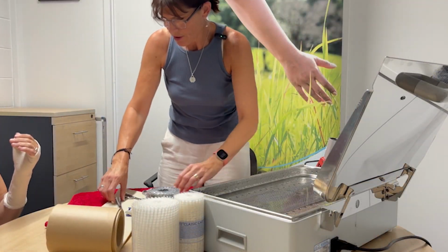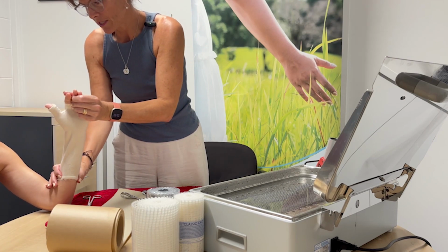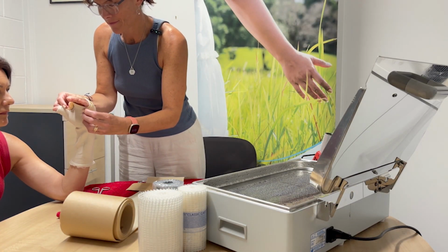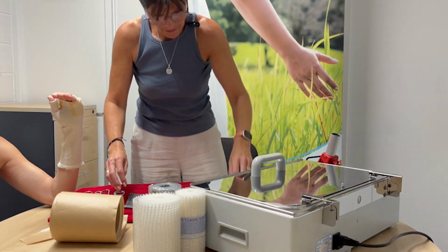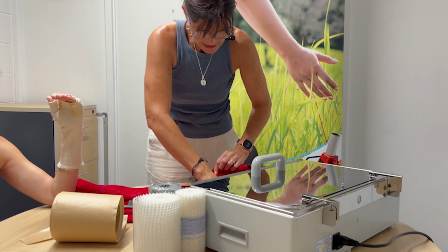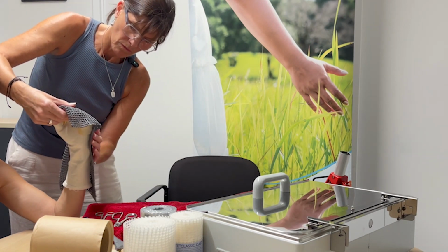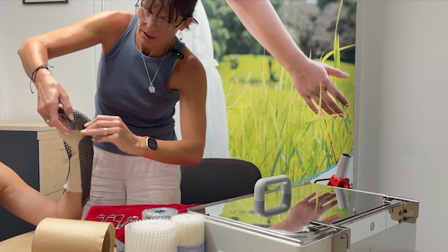While I'm doing that, I'm just going to put a splint sock or an underliner onto the patient's hand. I like to put a bit of foam padding over those MCP joints. Take the material out. Just squeeze out the excess water and really squish those layers together. The material itself is not hot at all, so it's really, really comfortable on the patient.